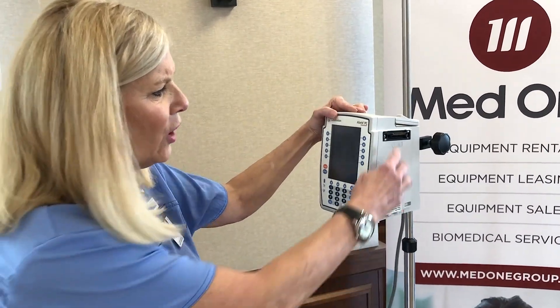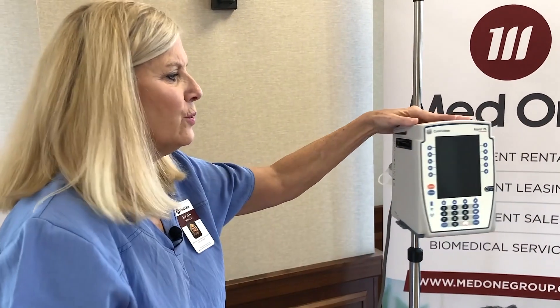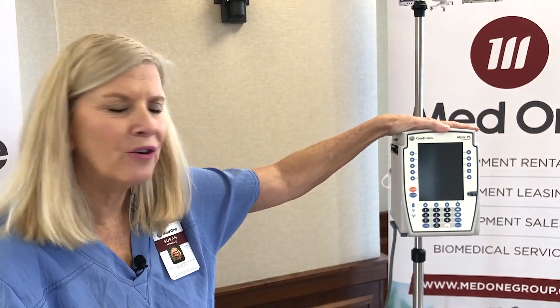On the sides of the PCU, you'll notice what we call IUI connectors. These are where the modules attach and reattach — up to four, depending on what the needs are in your hospital.